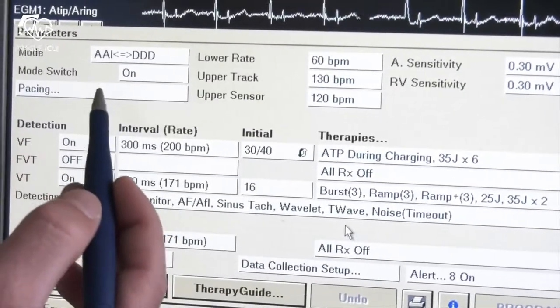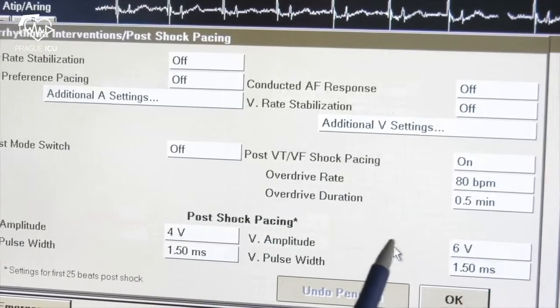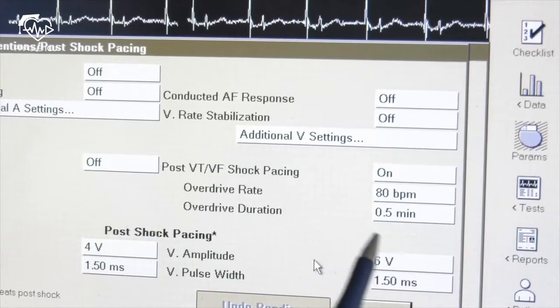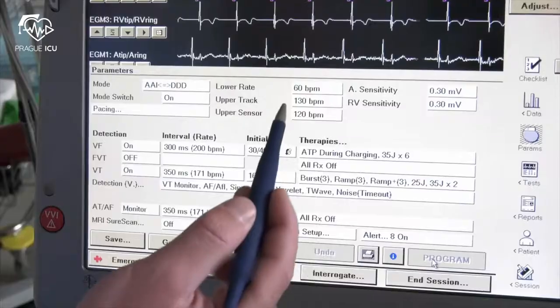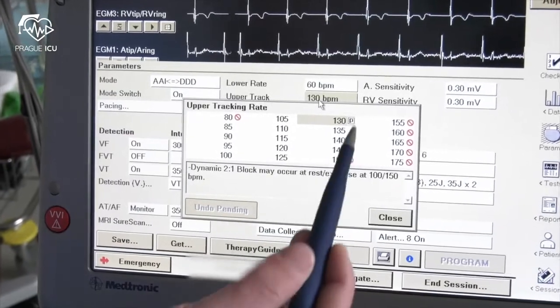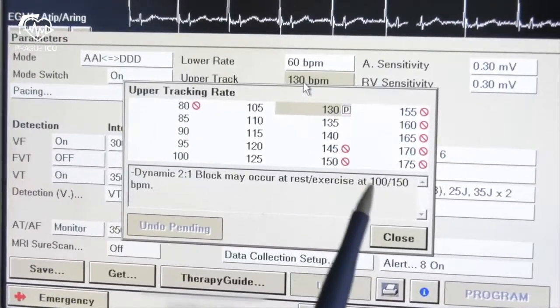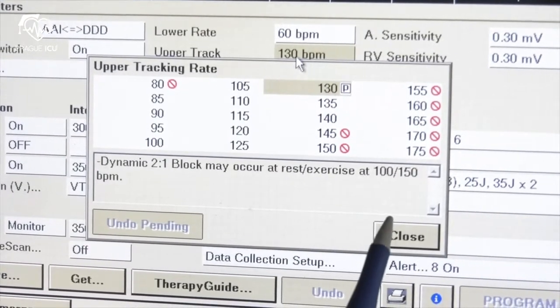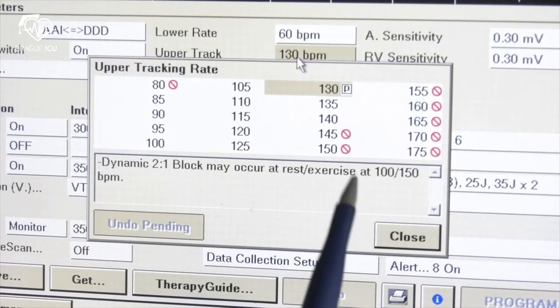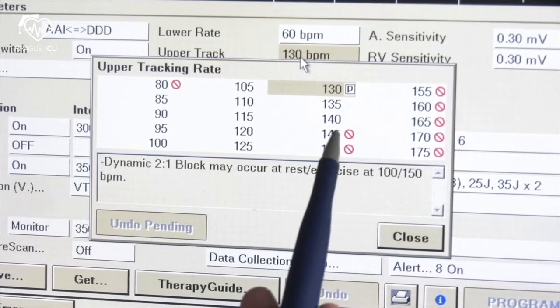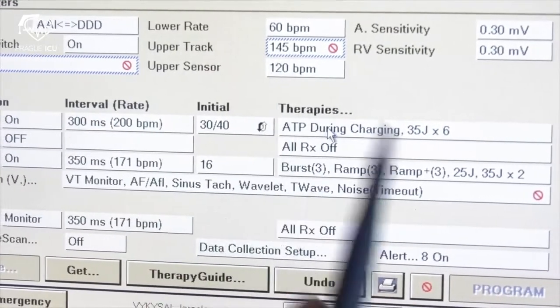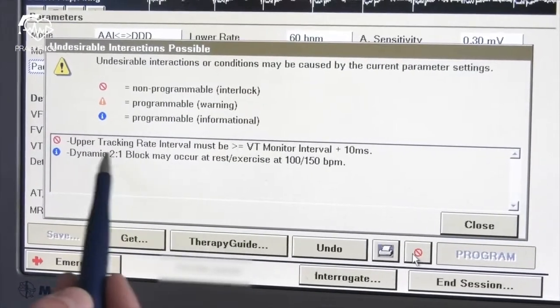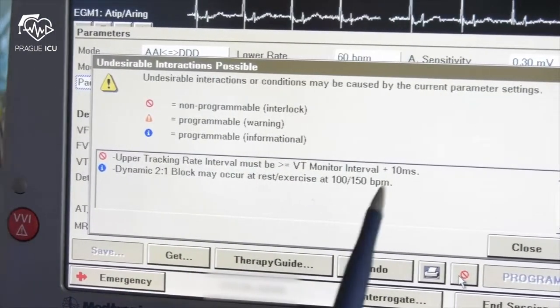In this scenario it is because of the active function of overdrive pacing rate of 80 beats per minute after shock therapy. Upper track rate is a function that allows setting how fast the device will pace the ventricle according to intrinsic atrial rate without intrinsic conduction to ventricles. In this device you can set the range between 80 up to 175 beats per minute. There is also a limitation in rates above 145 beats per minute with cross circle symbols. By clicking on a rate with this symbol, another cross circle symbol will appear in the lower part of the screen. By clicking on this symbol the appropriate reasons will disclose — in our case there is a conflict with the VT monitor interval.